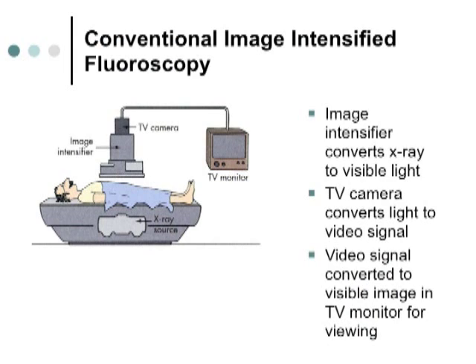The television camera tube basically converts the light image to a video signal. That video signal is carried through closed circuits to the television monitor, where it's converted back into a visible light image again. Okay? Now there are 3 tubes that we're dealing with here. We have the X-ray tube that operates at kVp, thousands of volts, usually 50 to 110,000 volts. It creates X-rays in a vacuum tube.